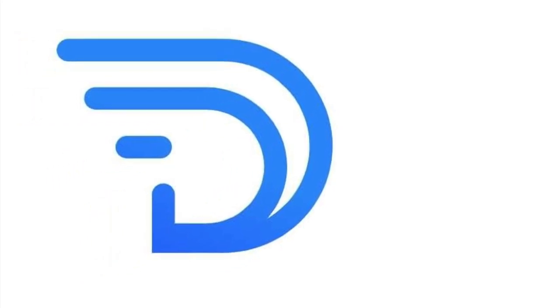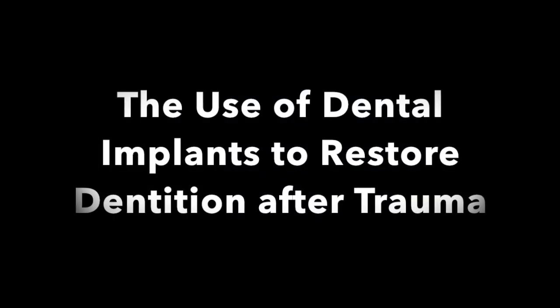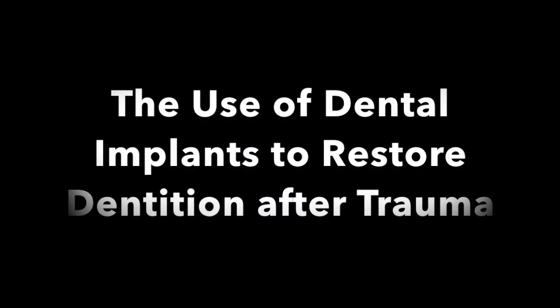Welcome to Dental Drone TV, where viewer discretion is advised. The use of dental implants to restore dentition after trauma.